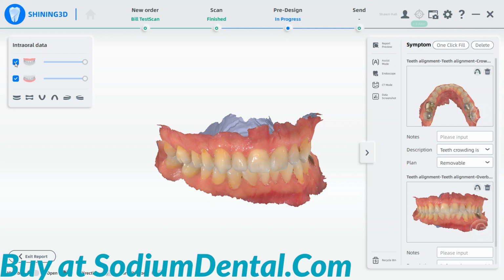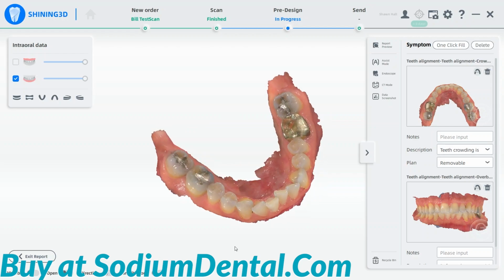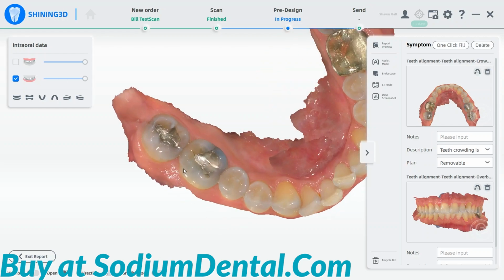First, I turn off the upper arch because I want to look at the lower arch. And I want to look at these amalgams. Potentially you're looking at a leaky amalgam. Or potentially you're just looking at a potential fracture and would like to send the patient home with some information about a suggested crown in the future.